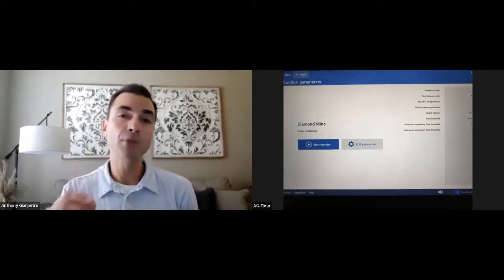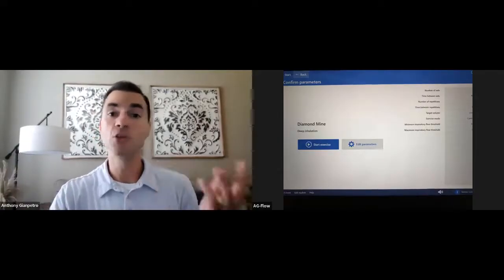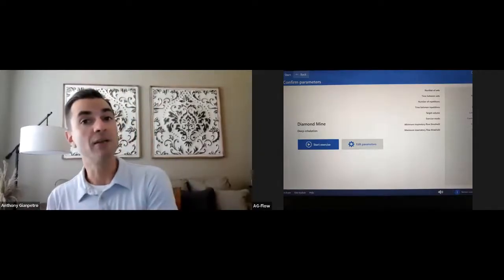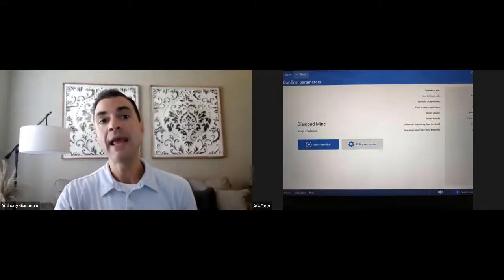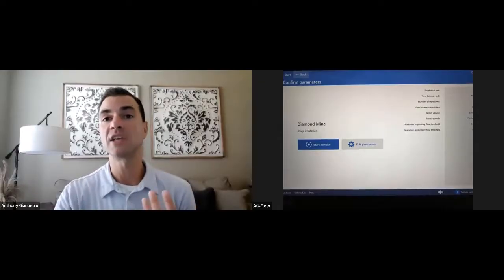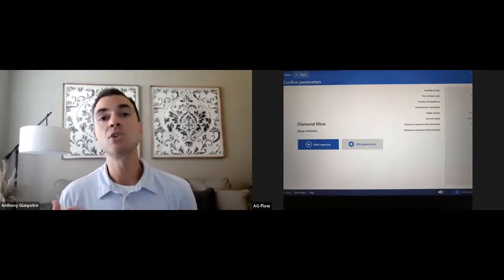Anything in that light blue color is an option for decreasing the challenge if you need to for your patient. Anything in green shows you what you can do to increase the challenge. It could be as simple as reducing the time between sets, or how many sets and reps you do, or increasing it, as we mentioned earlier. But if you want to talk about minimal threshold or minimal and maximal threshold, it's all outlined for you there. And that's true for every activity that I'm going to show you. I just want you to know that those are the resources you have at your fingertips if you need them. Okay, so going back to the original deck, the next activity is Prehistoric Contest.